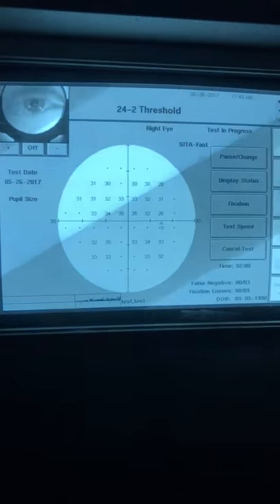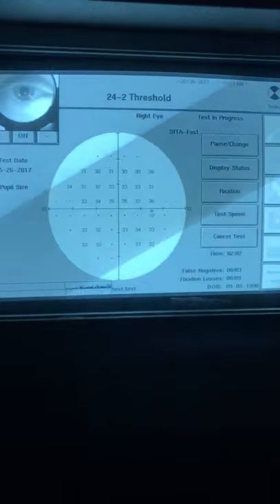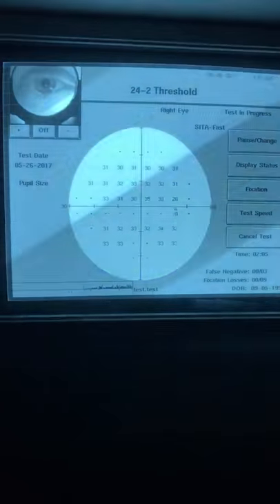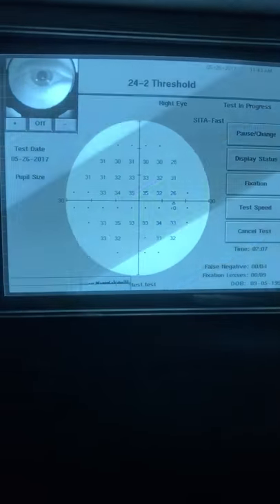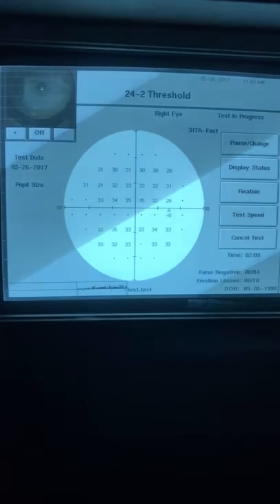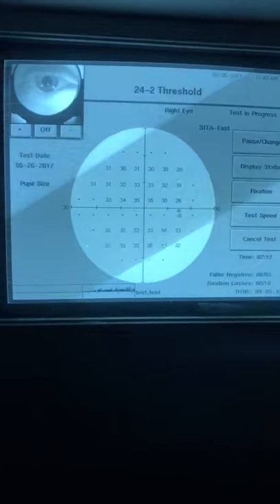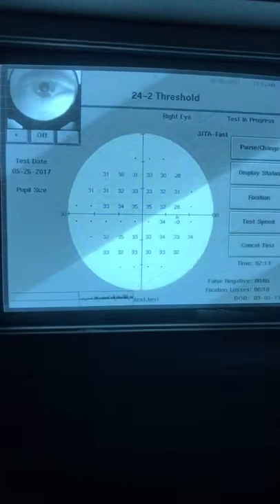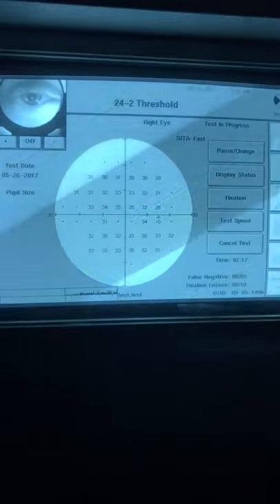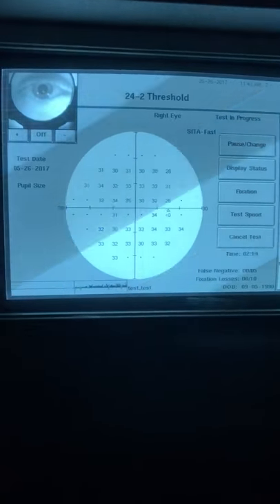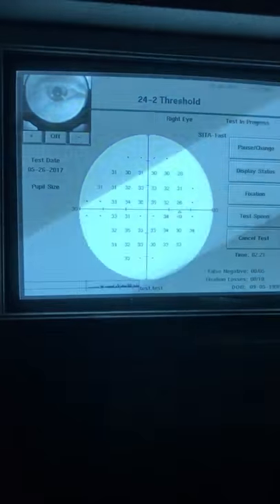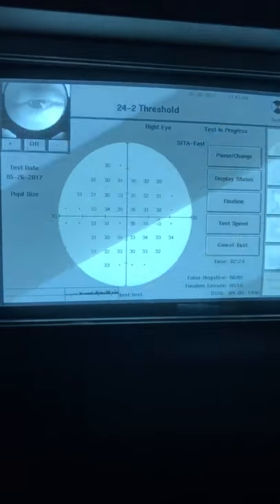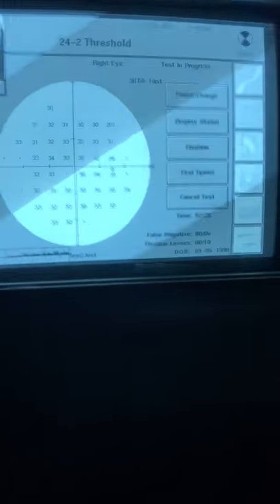The false negatives: if they click when a light appears that's very, very dim, and then later on in the exam in that same spot when a brighter light appears and they don't click, it will give you a false negative. Most likely they clicked by accident when that dim light appeared and they didn't see it, because they should be seeing that bright light. Both should be zero or as close to zero as possible.